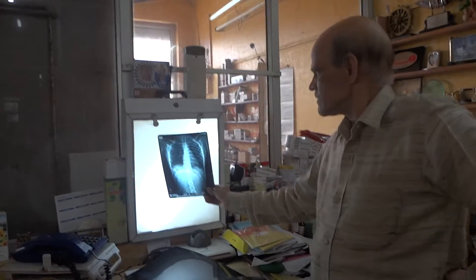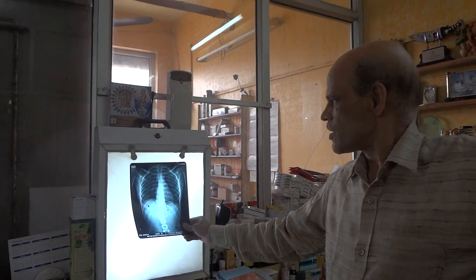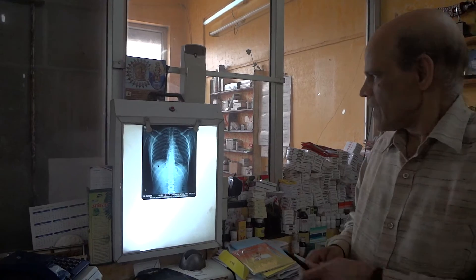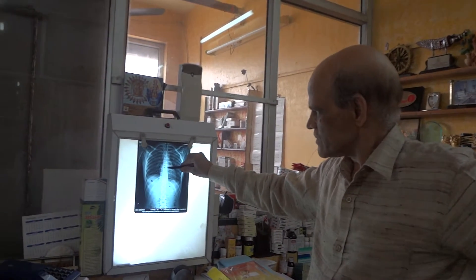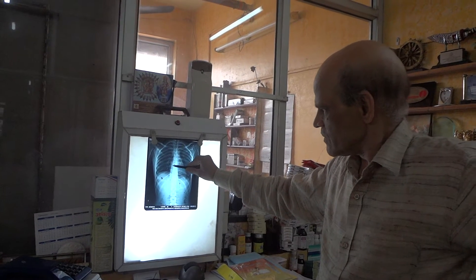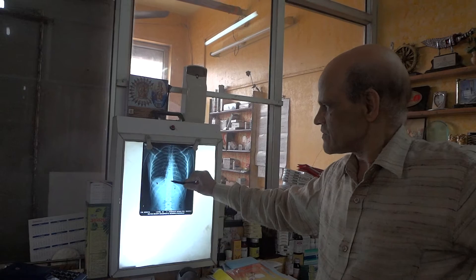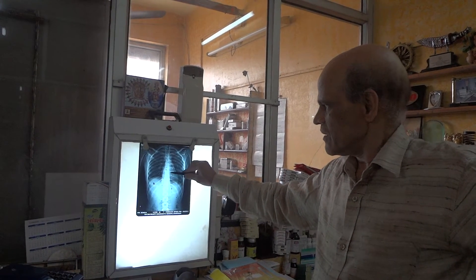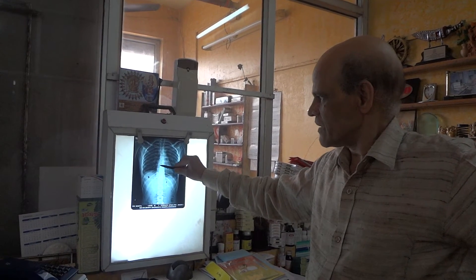This is an x-ray of a girl who had come to us with a prolonged fever. In this x-ray, there was an important finding that was missed by the radiologist. This is a cold abscess. There is a disease somewhere in the spine, and because of the accumulation of pus, the periosteum has got elevated. And this is a cold abscess here.